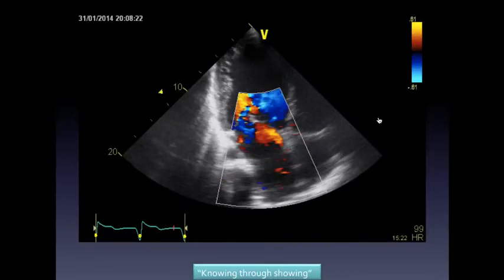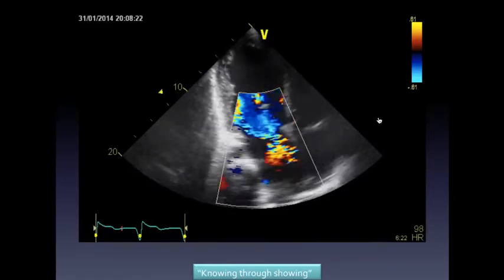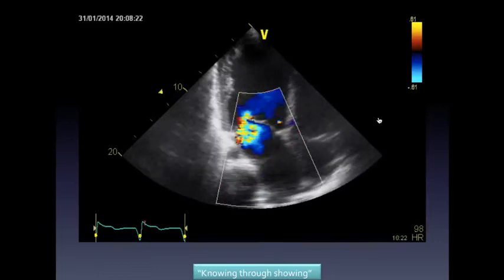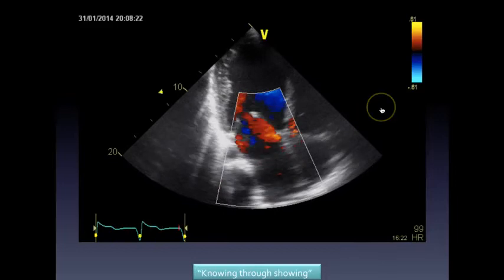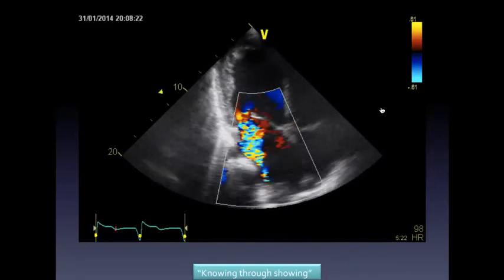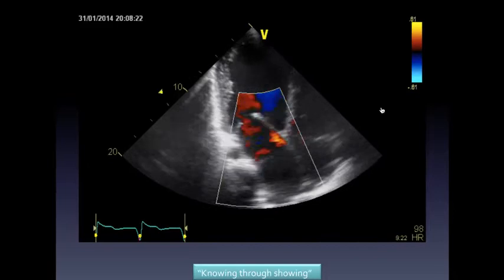However, this guy has at least moderate mitral regurgitation, and again, estimation of mitral regurgitation is at all times semi-quantitative. And in this case, his valve is actually structurally sound. This is functional mitral regurgitation. Because he's got a dilated left ventricle, the chordae are being tethered, so there's failure of coaptation of the leaflets. And what you'll often see is, even though that's supposed to cause central mitral regurgitation, because of asymmetry and the way the mitral valve is structured, often the posterior leaflet will be tethered a little bit higher than the anterior leaflet, so you'll get a slightly posterior jet of mitral regurgitation.